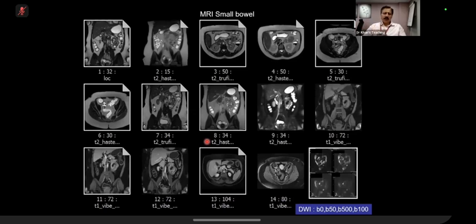So here I am going to teach you a bit about MREs. Please remember that MREs now are bread and butter in the exam, and many a times they have come in the exam. In MRE, for example in my department, we are using mannitol, but you can use many things, and about 10 different things have come in the literature where people have used juices, milk, and many things, but we use mannitol.